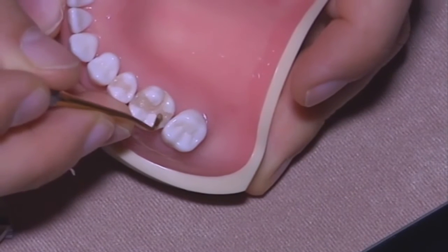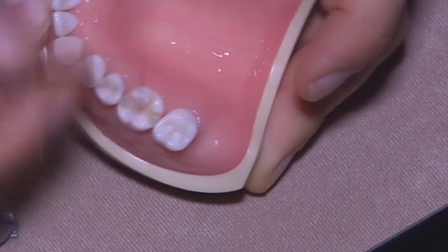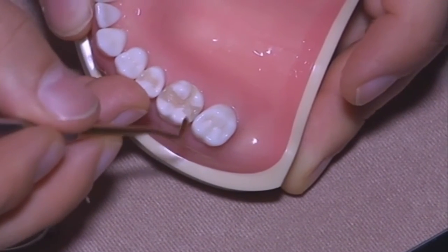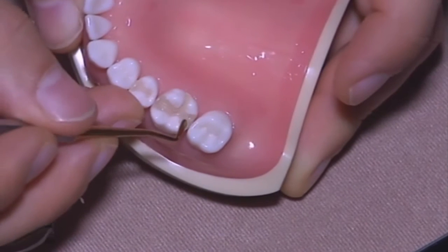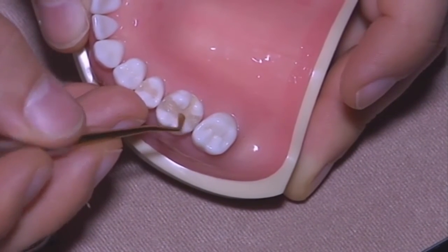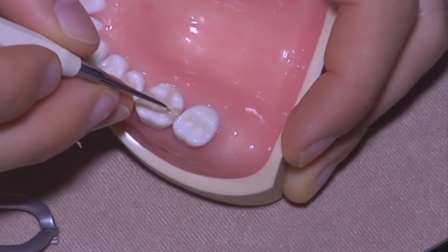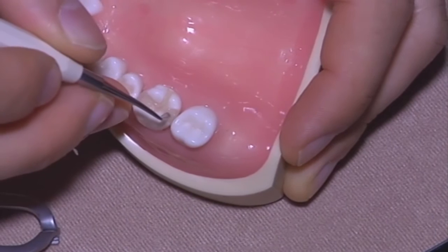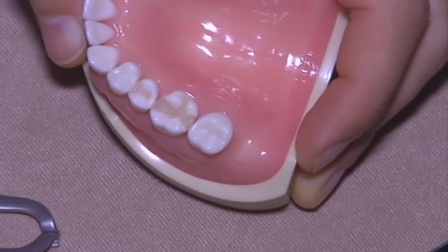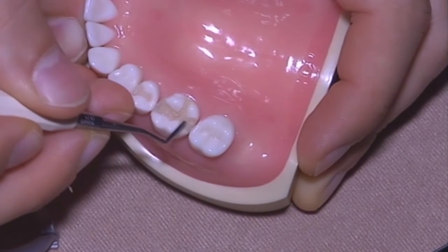The only thing you have to do is, with a spatula, follow the inclination of the crest you have. And again, I prefer to work cusp by cusp.